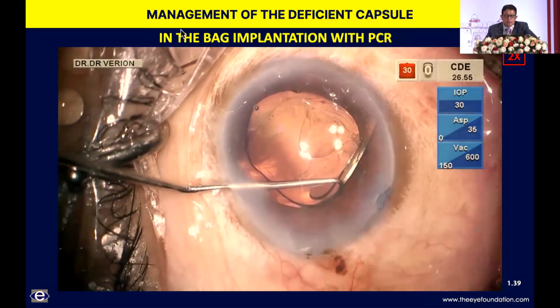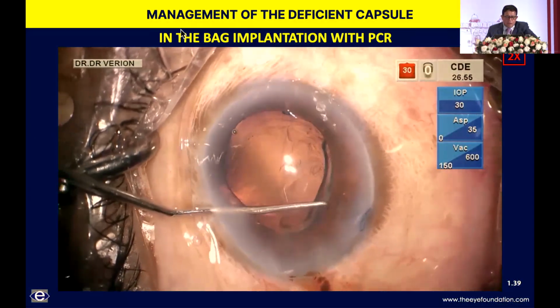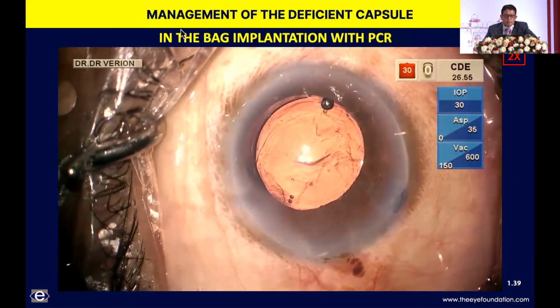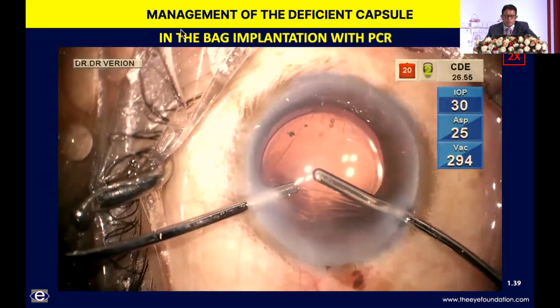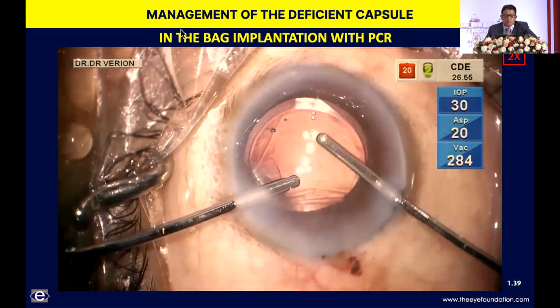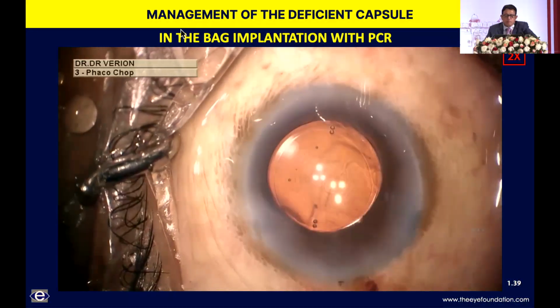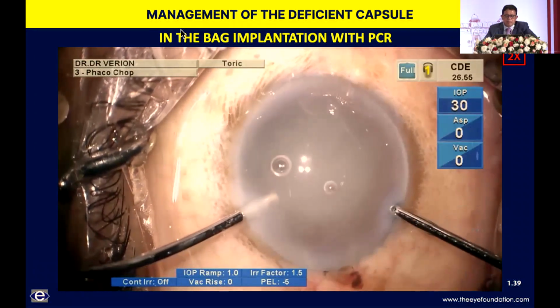I have not done any anterior vitrectomy in this case because the anterior vitreous space is tamponaded, and though the orientation of the haptics has to be around the area of the rent because there's a capsular support available, as you can see with the digital overlay that will come on towards the end, I'm able to exactly position the lens in the direction where it's meant to be.